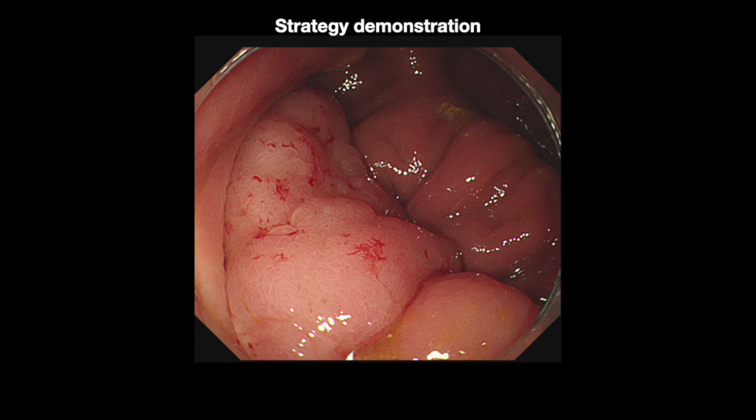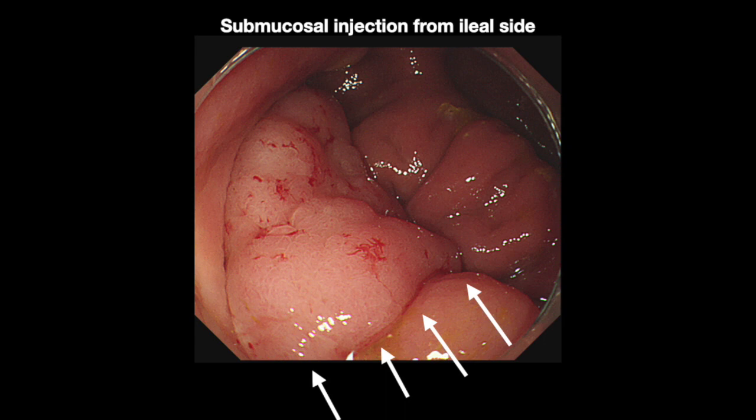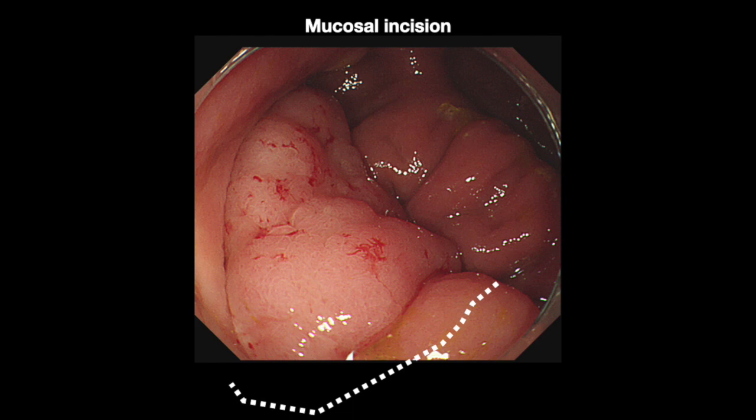Here is our strategy. All procedures should be done from the ileal side to prevent the tumor from retracting into the ileocecal valve, including submucosal injection, mucosal incision, trimming, and dissection.